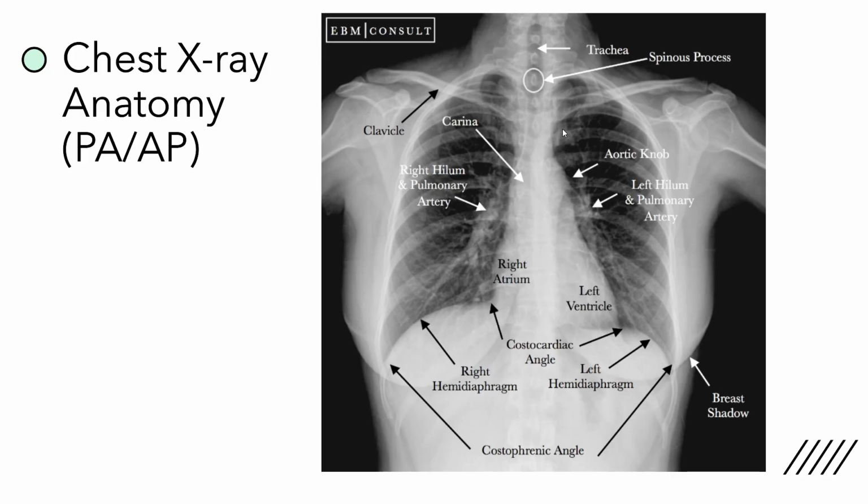We can't really see a ton of the sternum here. There's a lot of overlapping with the mediastinum, the sac that holds the heart and a lot of other structures. But we can see the clavicles on either side, your collarbones. We also have our scapula that are nice and out of the way, and the humerus, the first long bone in the arm.